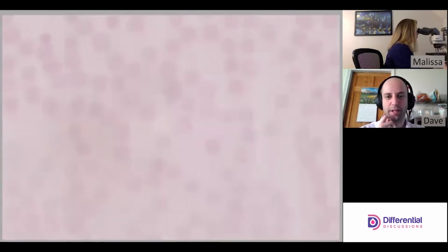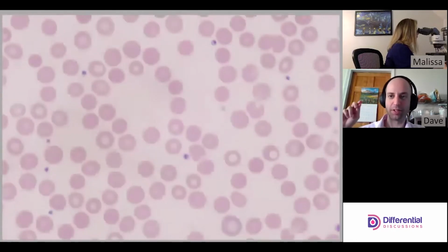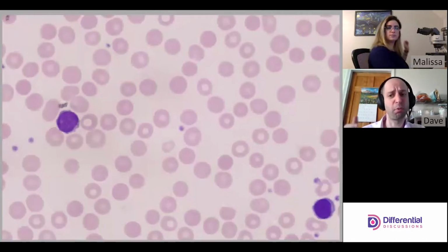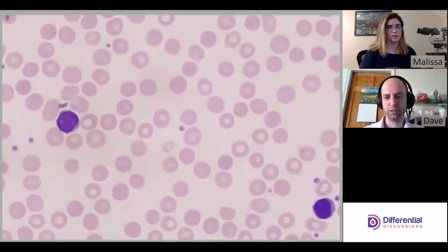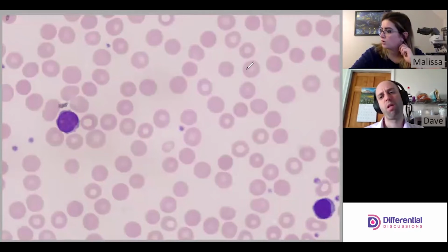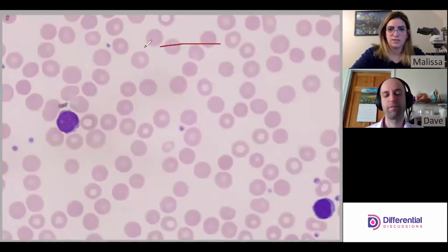Yep. And she's being systematic about this because we don't want to just cherry pick fields when you're doing a normal differential. We may at some point decide to cherry pick, but that'll be just for teaching and morphology, or showcasing. But just like I drew the other day, how to find good fields, probably where I drew it there.